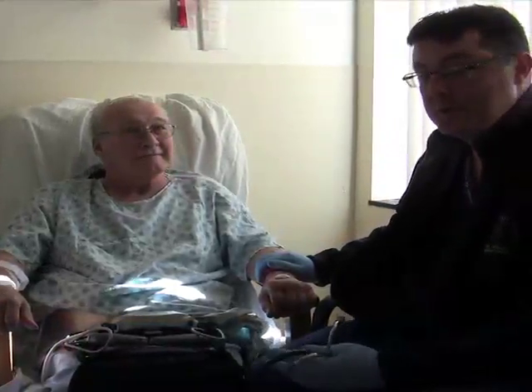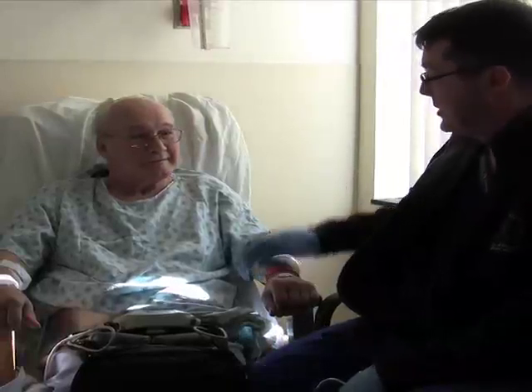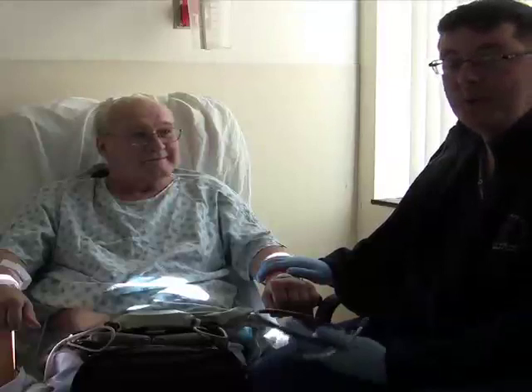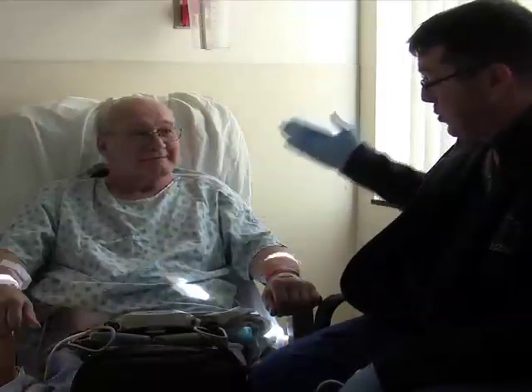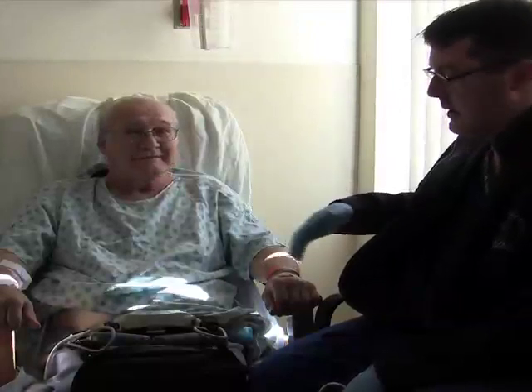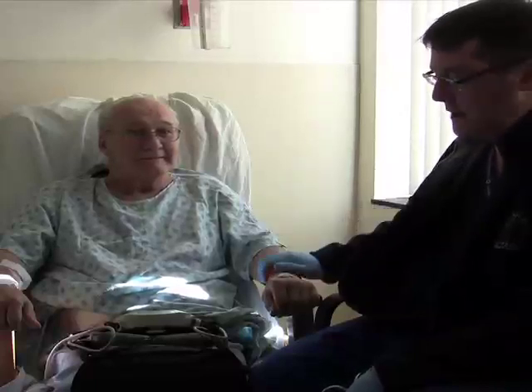The normal exam of a VAD patient has some things that are different from a normal exam of a person that's using their own heart to keep themselves alive. The things that we look at: first, what does the patient look like? A patient on a VAD should not exhibit signs and symptoms of heart failure. They should be breathing normally, have good color, and should be free of the edema and failure findings that you'd find in someone else who's suffering advanced or late stage heart failure.